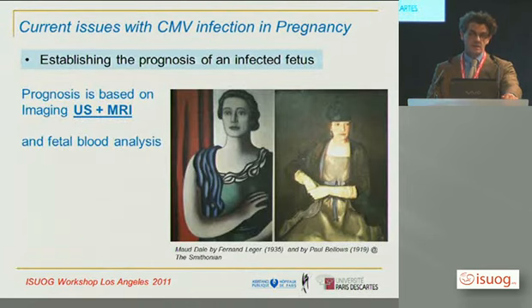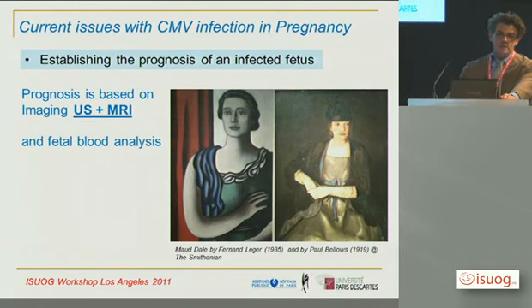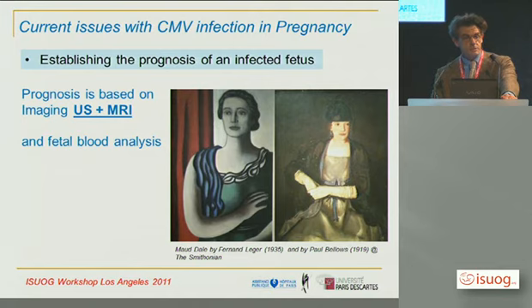And second, imaging now doesn't mean ultrasound alone. Imaging means ultrasound and MRI. And there is no debate, and there is no conflict as to which one is better than the other. We've discussed that this morning. It is particularly true for infection.